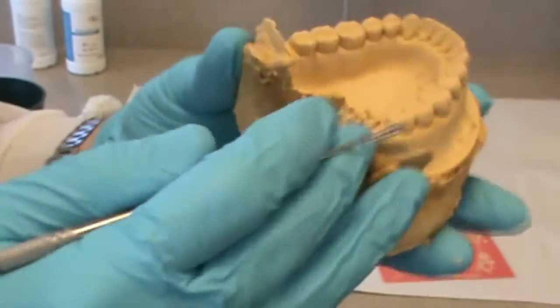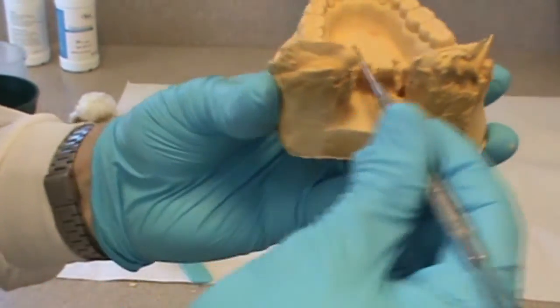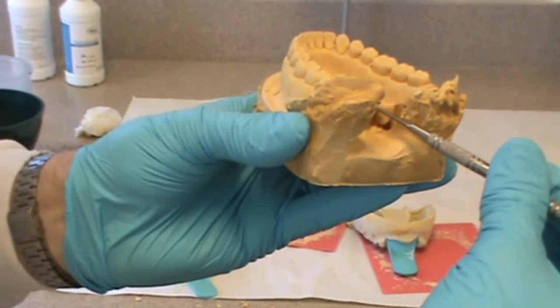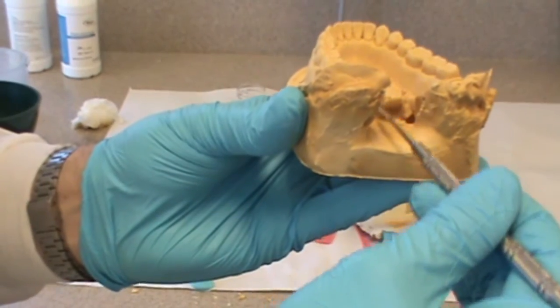So I go through and remove all the nodules from the occlusal surface. Again here on the lingual, it needs about eight or nine millimeters of stone there that I'm going to add in another step.